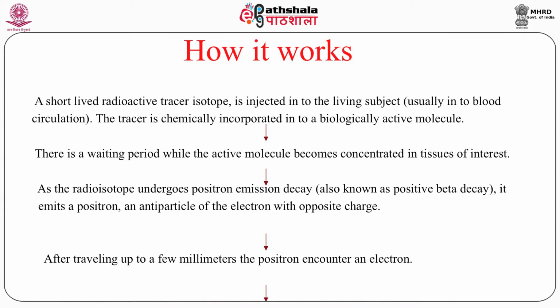What exactly happens is, the patient scanning does not start then and there itself; before the scanning, the patient has to be kept waiting for 45 minutes. Why 45 minutes? So that the activity is uniformly distributed and you get a good quality image. And the patient has to be kept at rest, because during movement it may so happen that the activity gets concentrated in the muscles. So the information which you are looking for, you may not get.